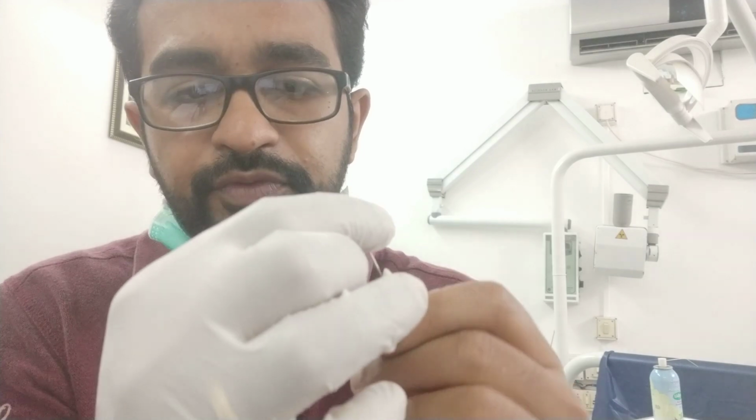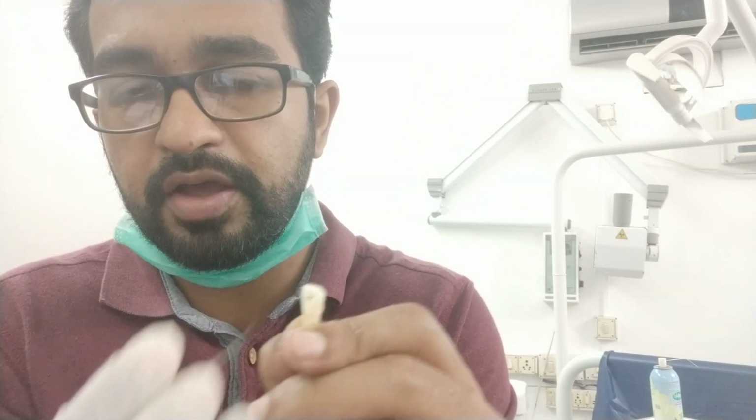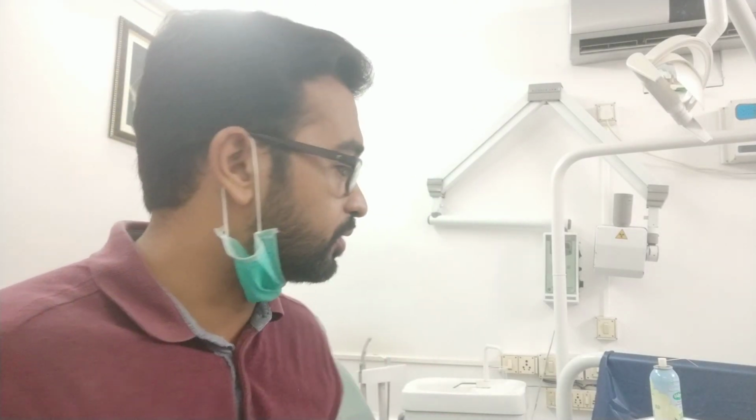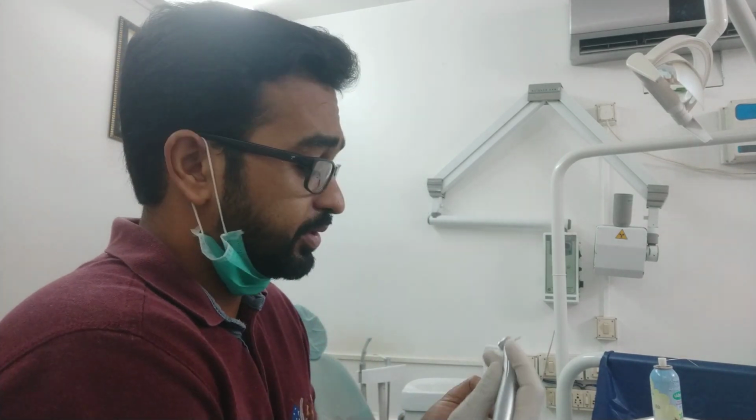You have to remove the extra dentine which is present above the ditch hole you have made. So I will remove the extra dentine above the ditch hole. I don't know whether I am doing justice to the camera or not, but this is the way it is. So I will extend the ditch hole which I have already made.